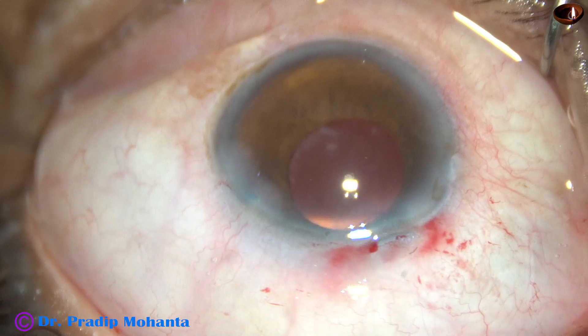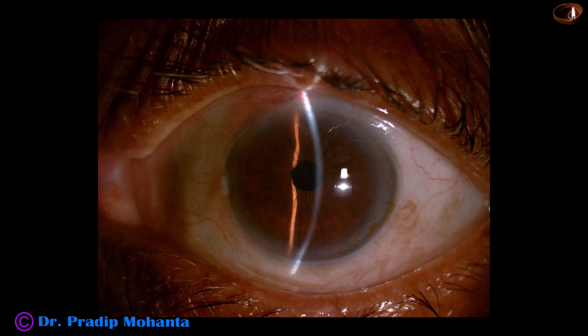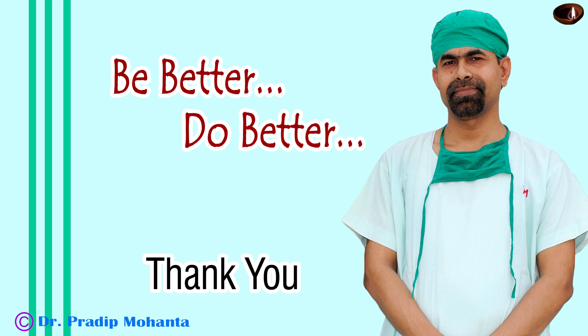And these are the post-op pictures. See how beautiful the cornea is — cornea is clear all around. This is a first post-op day picture. Intraocular pressure is 14 mmHg. And this is the optic nerve seen by 90-diopter adapter, and this is the macula. So this is a very satisfactory result on the first post-operative day.